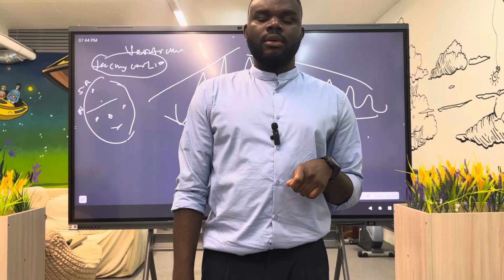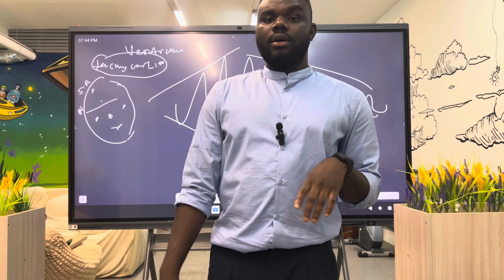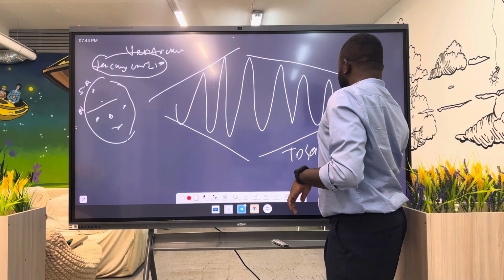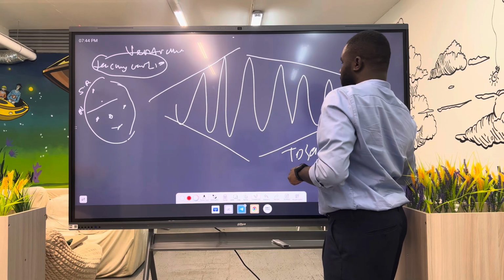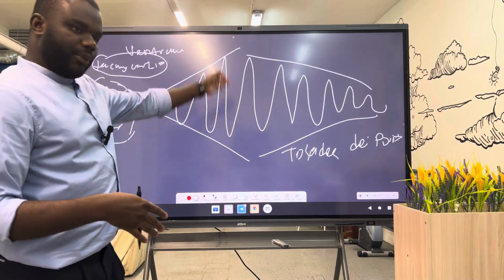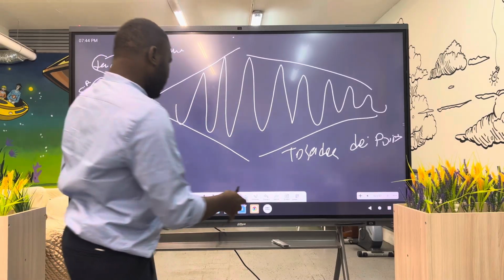But if you intend to shock, then you need to give what? Analgesics, in order to prevent the patient from the pain. Sorry. So polymorphic VT, this is known as what? Torsades de pointes. So now with all I have taught, we'll be doing some lessons from it. I'll be bringing some live ECG onto the board and then we'll talk about it. Okay.